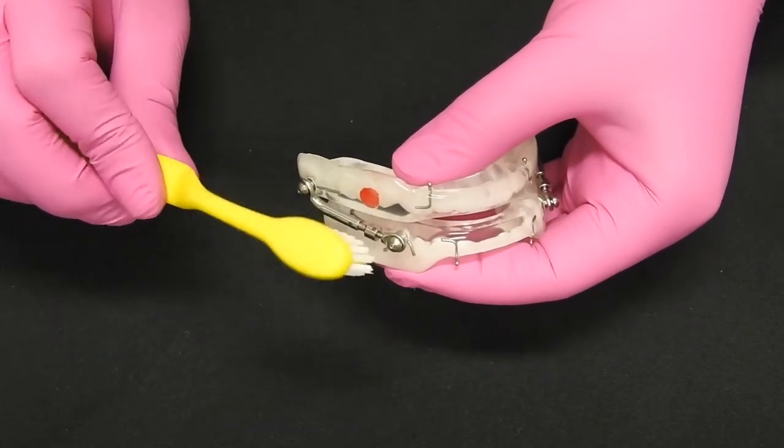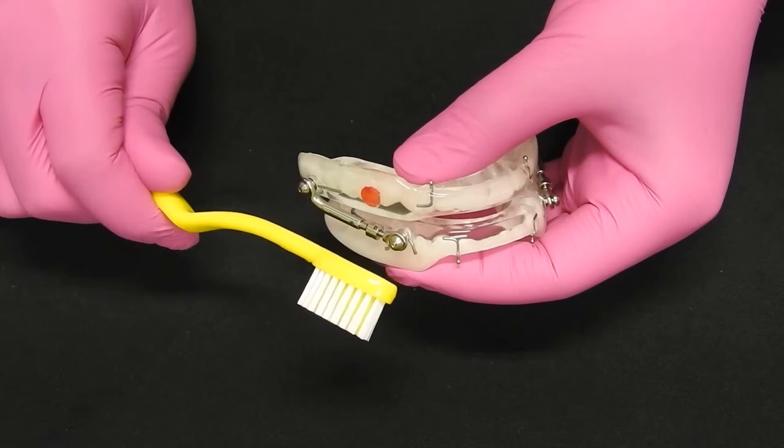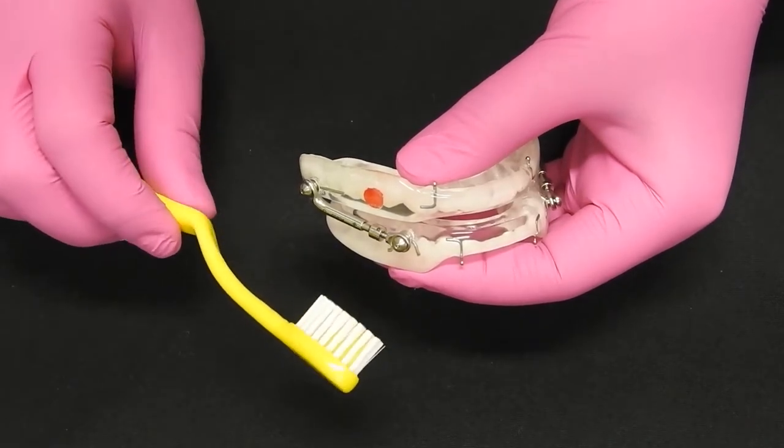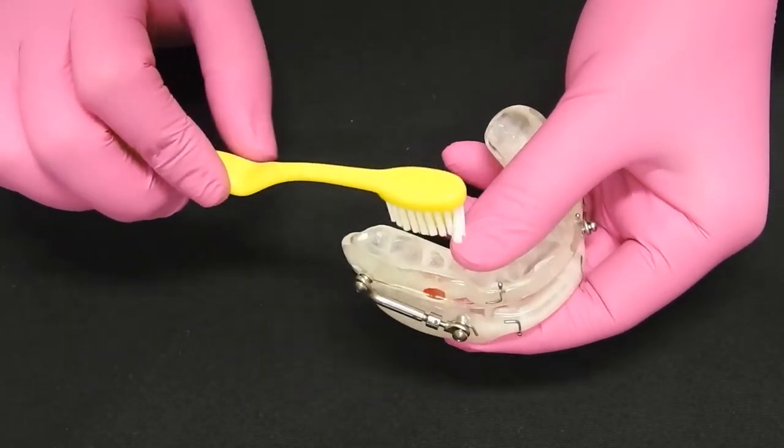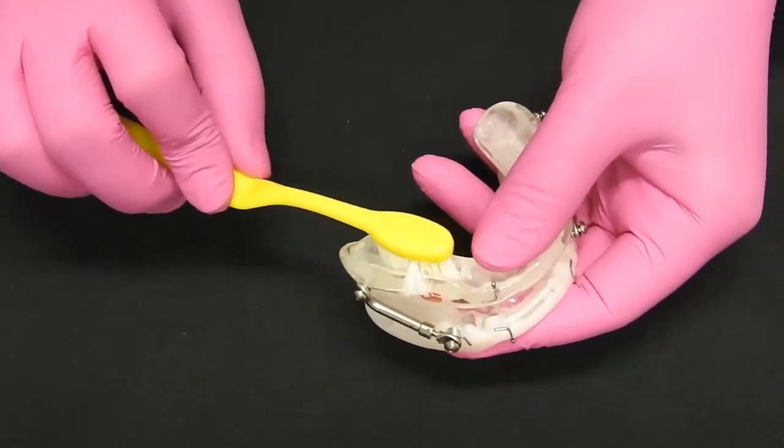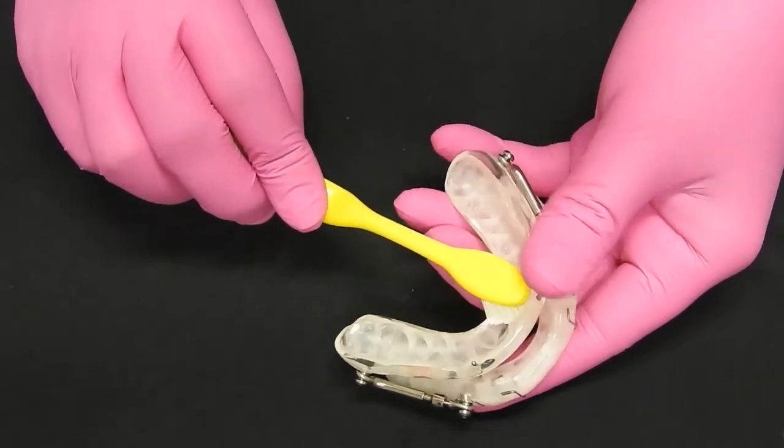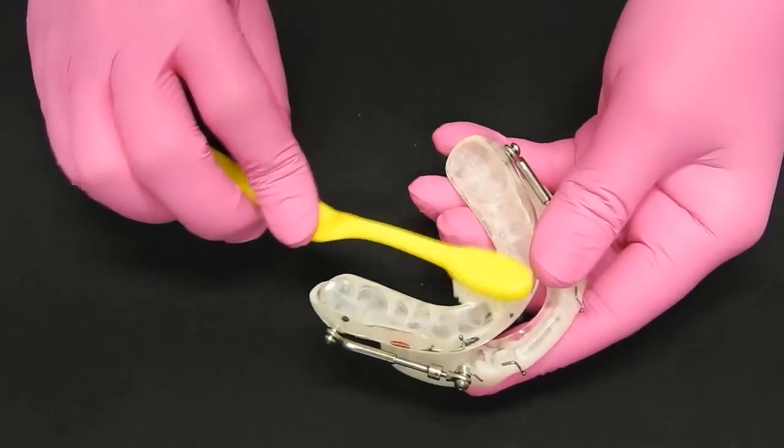Take your toothpaste or soap and put it on your soft-bristle toothbrush with water, and brush inside where it contacts your teeth.